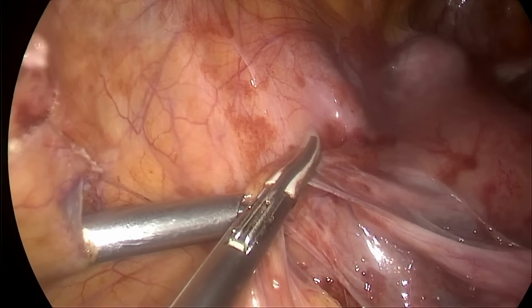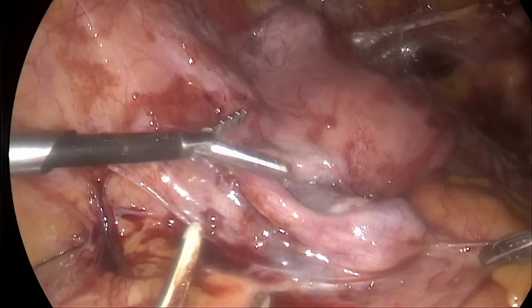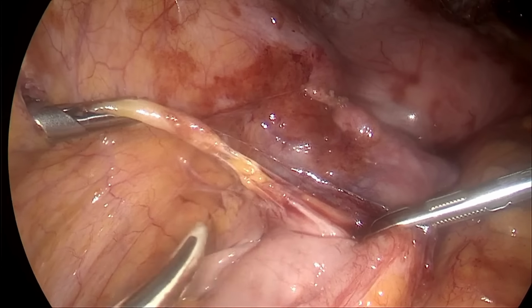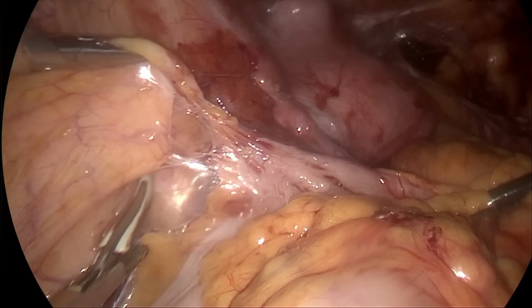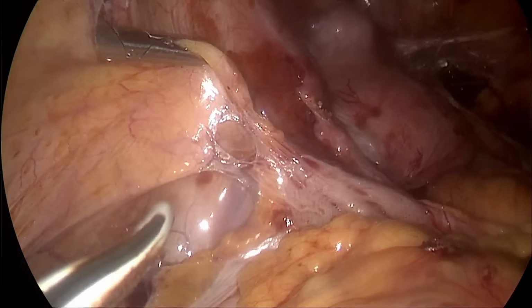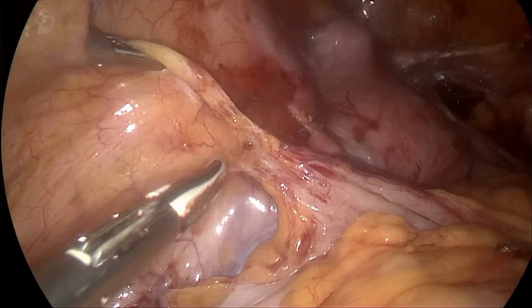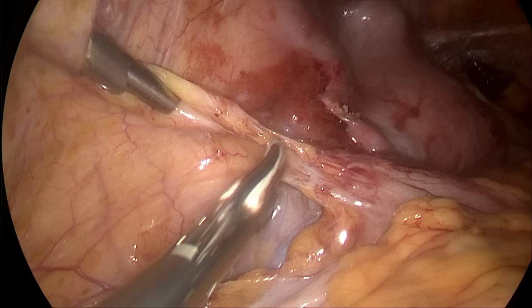Now on the left side, some sigmoid adhesion. So we have to open the sigmoid adhesion to enter the retroperitoneum to get a clear view of the retroperitoneal structures and retroperitoneal anatomy. So counter traction and traction help very much in identifying the proper plane.